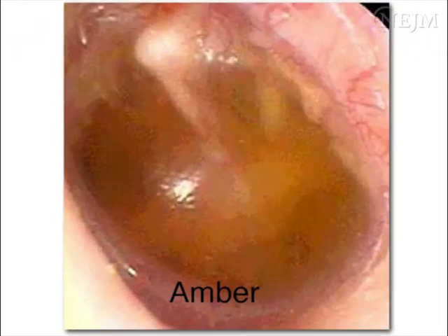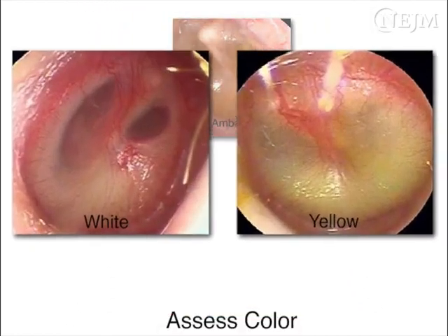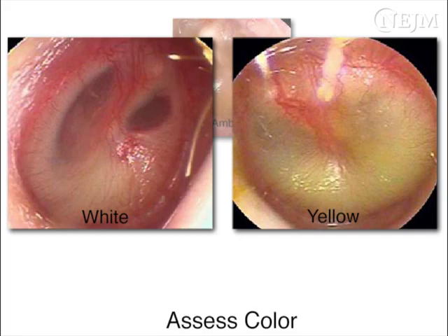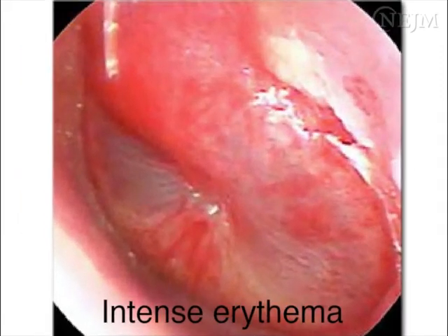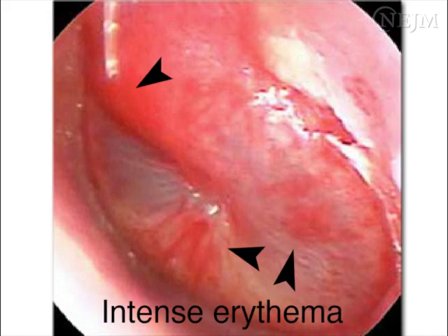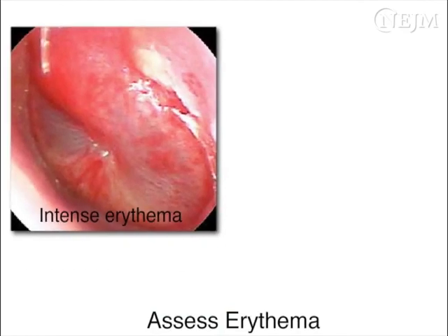Assess the color of the tympanic membrane. Although color alone is not diagnostic, an amber color usually indicates the presence of otitis media with effusion. White or yellow discoloration may be seen in both acute otitis media and otitis media with effusion. Look for areas of intense erythema on the tympanic membrane, a finding that indicates acute inflammation. When present together with opacification and bulging of the tympanic membrane, this finding supports the diagnosis of acute otitis media.